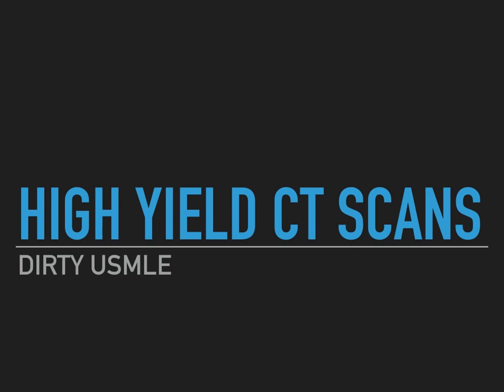So sometimes they'll show you a scan with different structures lettered from A to E, and they'll say, what does E represent? Or they'll show you a CT scan and ask you to extract information from that, and they'll have something starred and say what type of pathology might you expect if this is the patient's CT scan. There are all types of ways that they can give you these questions, but the bottom line is that CT scans are high yield and you have to know them.